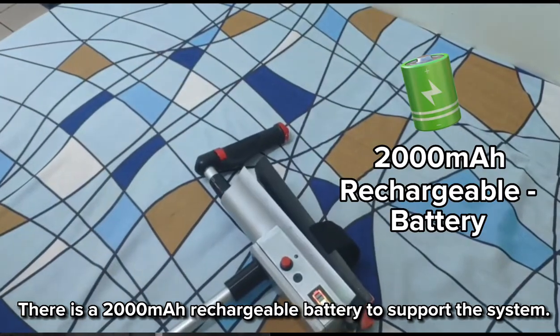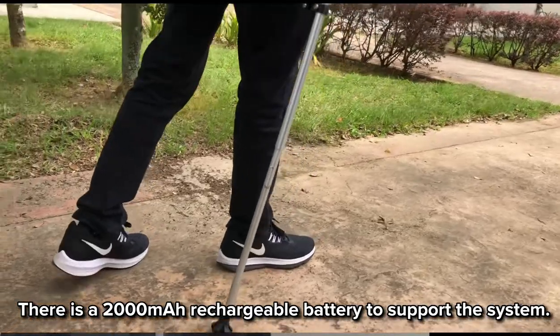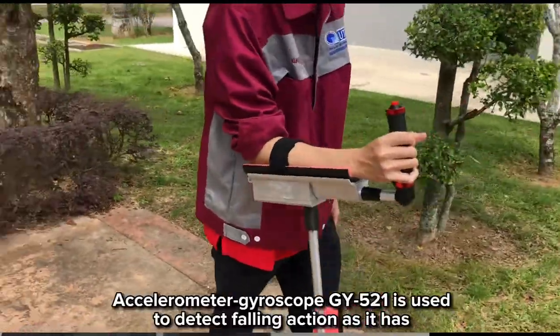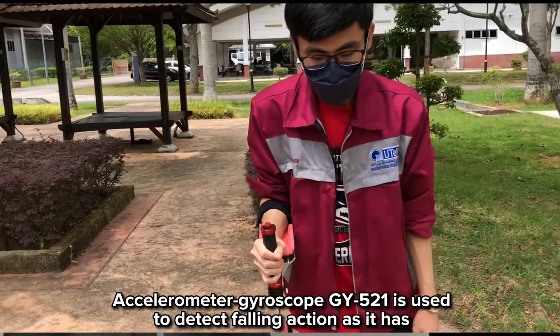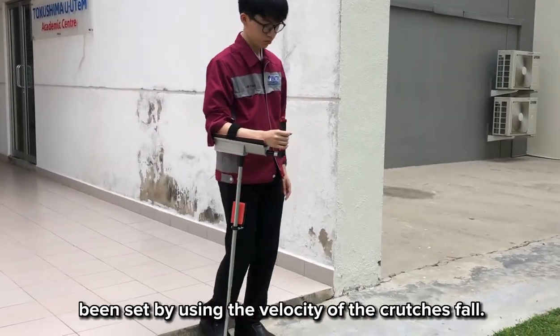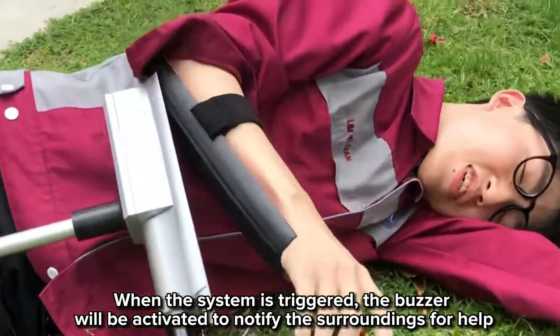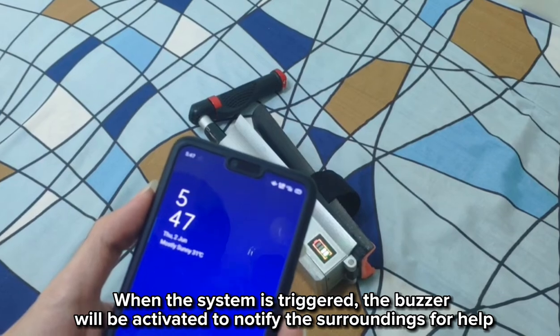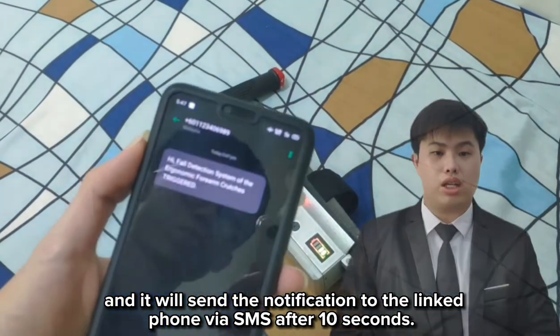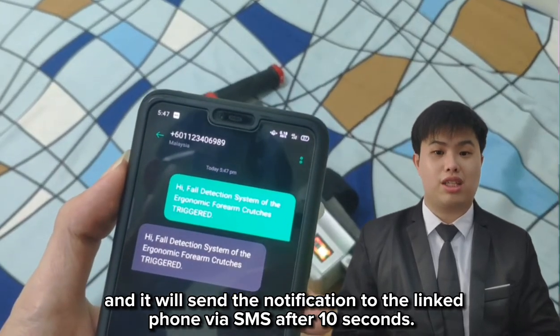There is a 2000mAh rechargeable battery to support the system, with a charging duration of 10 hours. An accelerometer and gyroscope module is used to detect falling action, as it has been set using the velocity of the crutch. When the system is triggered, the buzzer will be activated to notify surrounding people for help, and it will send a notification to the linked phone via SMS after 10 seconds.